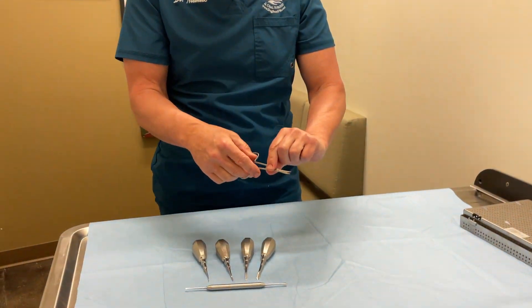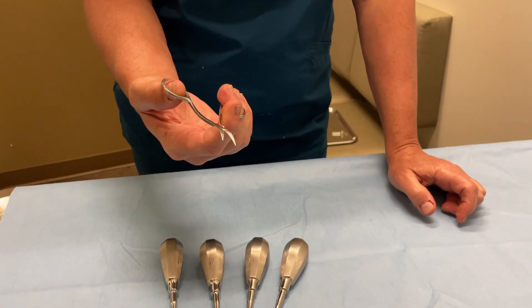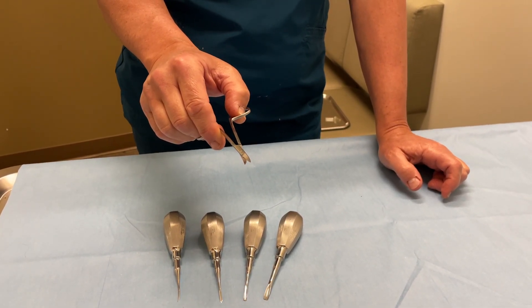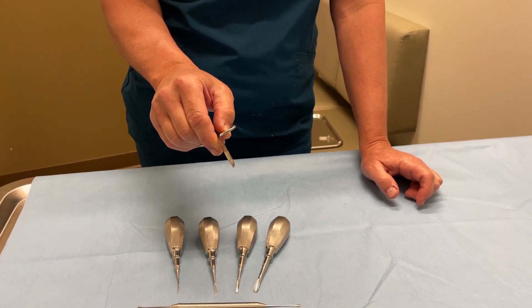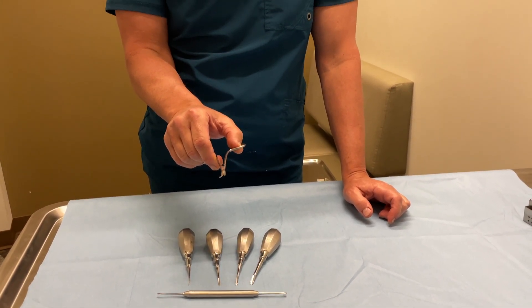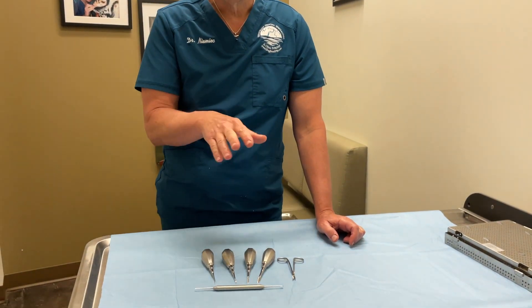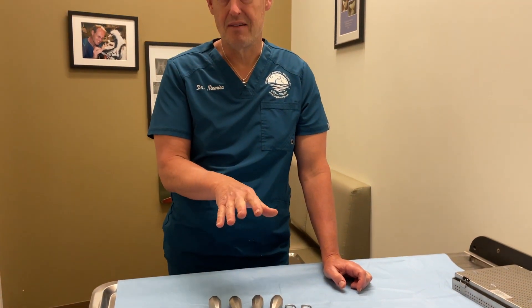And finally, this is my favorite piece of equipment. These are called Legrand scissors. Legrand scissors are simply curved irises, serrated on one side, smooth on the other. This is what I do most of my surgeries with after I've made my initial incision. This is excellent for fenestrating the periosteum in your surgical extractions. So this is the mini or relief vet extraction kit, and it's available online.